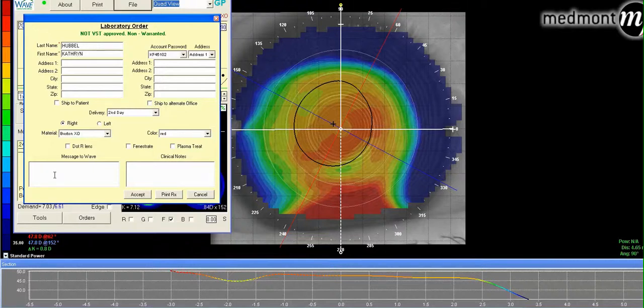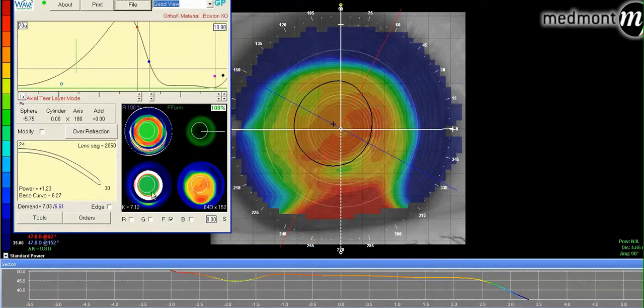That way you can have the patient observe in the mornings to see if the lens is oriented correctly. It's good to know if a freeform lens is turning on the eye, because if it is, then that kind of negates all of the freeform design we put into it. Just ask the patient when you next see her whether the lens does have that black dot at the bottom of the lens, and hopefully it is staying oriented, and that'll get your patient seeing a little bit better with better looking post-wear topography.